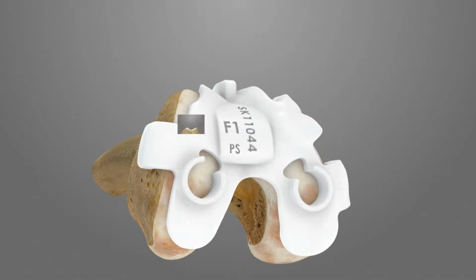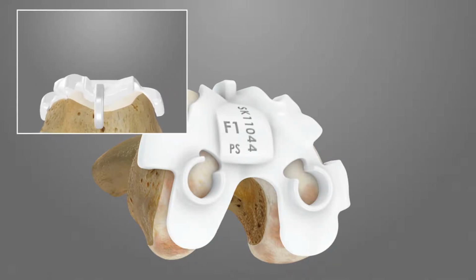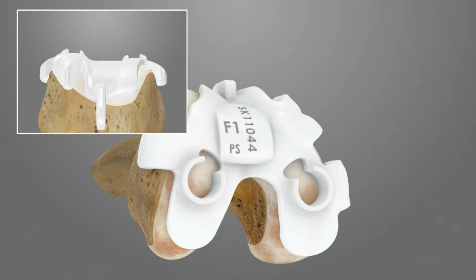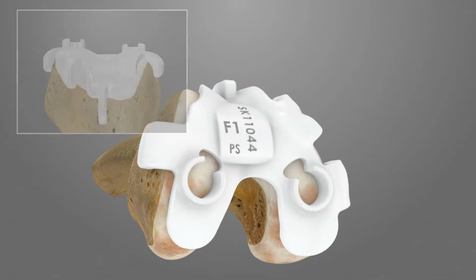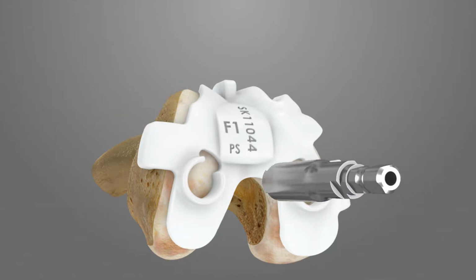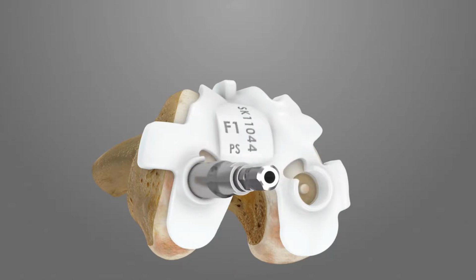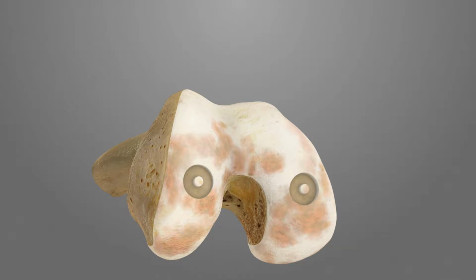The anterior stylus will reference the anterior cortex. The femoral iJigs have been designed to fit over 3 millimeters of cartilage. There may be some space between the iJig and femur where there has been cartilage loss. Using the coring tool, core through the two distal holes of the F1 iJig down to subchondral bone. Remove the F1 iJig. Using a curette or rongeur, remove any residual cartilage within the cored holes.